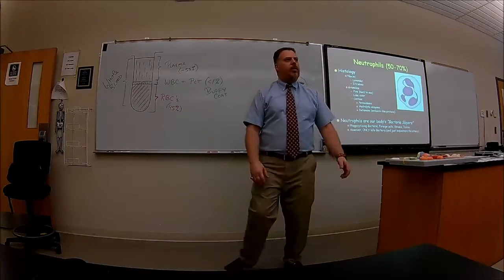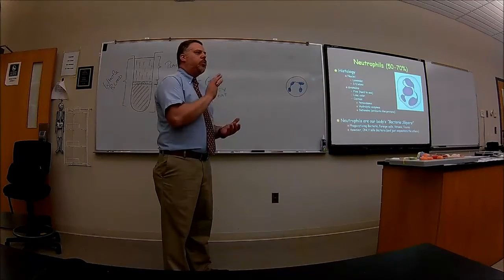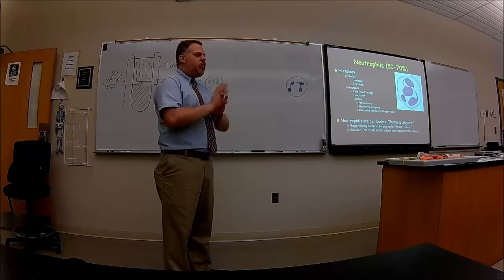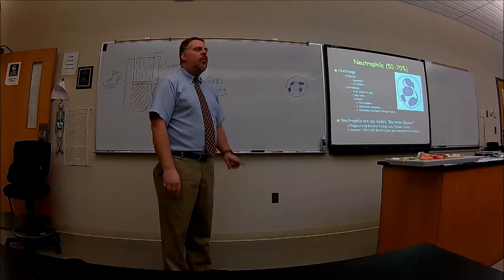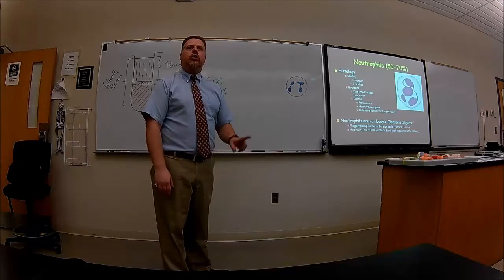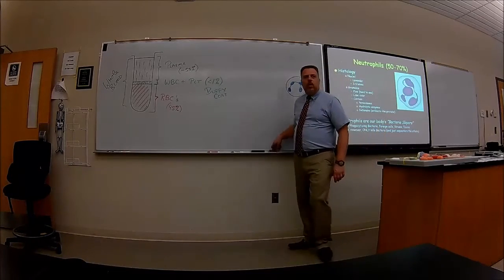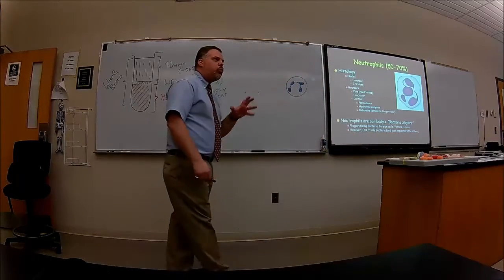They only kill bacteria. So if I ask you, what is this cell? And you say neutrophil, and then I ask, what's the function here? And you say, kills viruses? That's wrong. Phagocytize viruses. Kills bacteria, yes, because there's another cell that kills viruses. Not this one. Does that make sense? Got to pay attention to those words.